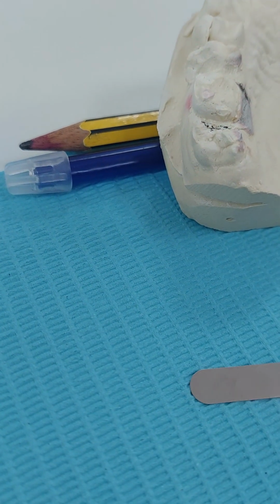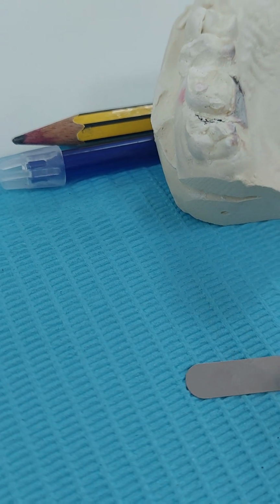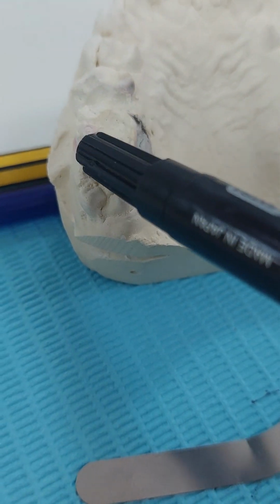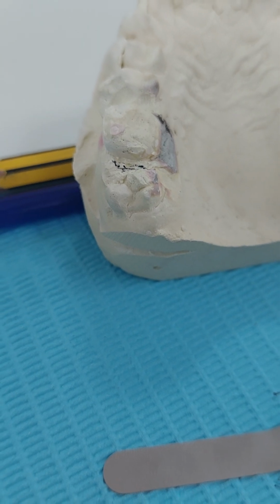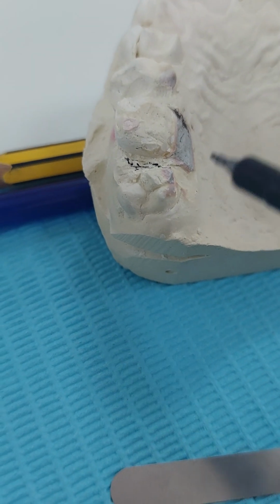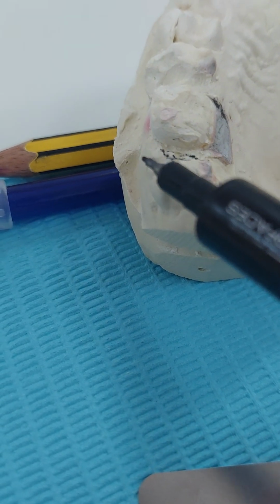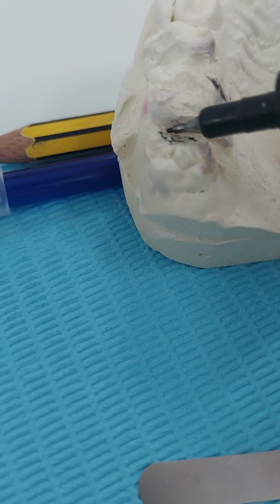These edges will keep bumping into the col area or the gingiva, right? It will not wrap around the tooth because this gingival level is higher than the gingival level here. It will prevent you from seating deeper. Many times when you place the matrix, here it's adapted, here it's floating above the margin because the margin is very deep here. It's between the teeth.